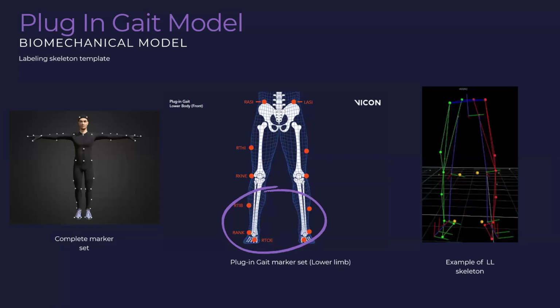So for that, I'm going to use the center of pressure trajectory that I will be predicting with my insole to know first where I am in my gait stage, my gait phase. Depending on which stage, which phase I'm in, the requirement for the torque that I need to apply to the ankle joint will be different. And also, based on that, I can know if my exoskeleton is going to create some unbalanced motion, some perturbation for the subject.